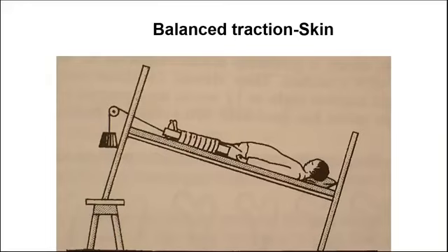One thing I want to mention here is that if you have this system in your hospital, ensure that the weights conform to the Kenya Bureau of Standards, and these weights can come in form of kgs, in grades of halves or ones, up to 5 kgs. The pulleys don't have to be very standard, but they should function as a pulley.